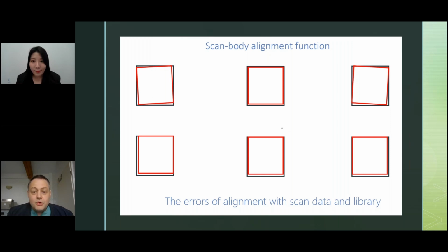And I would personally avoid, from personal experiences, scan bodies that are milled or made in local labs, or printed or milled by yourself in your clinic. So buy original parts and you're going to get good results. Avoid any parts that you make yourself. And in addition, Medit only provides scanners, not the scan body. Yeah, unfortunately.